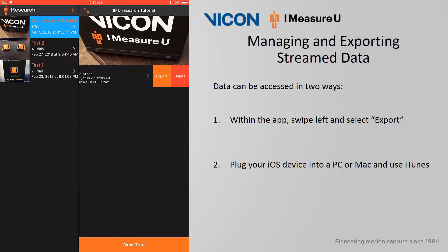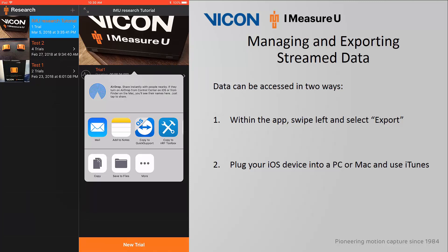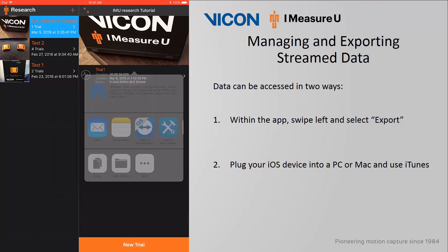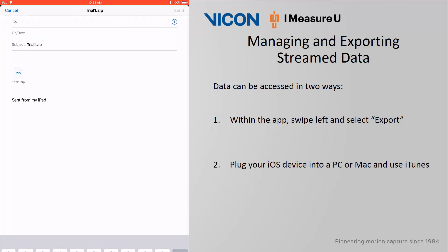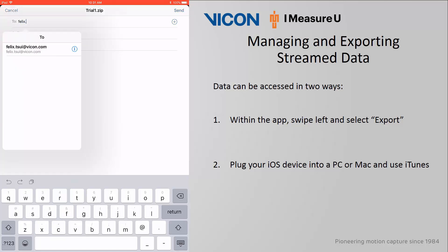To manage the trial, swipe left on the trial name. You will have two options: either to export or delete the trial. If you choose to export, you will be presented with a menu of options. The easiest and most straightforward export option would be to send yourself an email — just remember that you must have a pre-configured email on your iOS device. I will click on Mail, type in my email, and you will notice a zip version of the trial has been attached to the body of the email. I will then click Send.